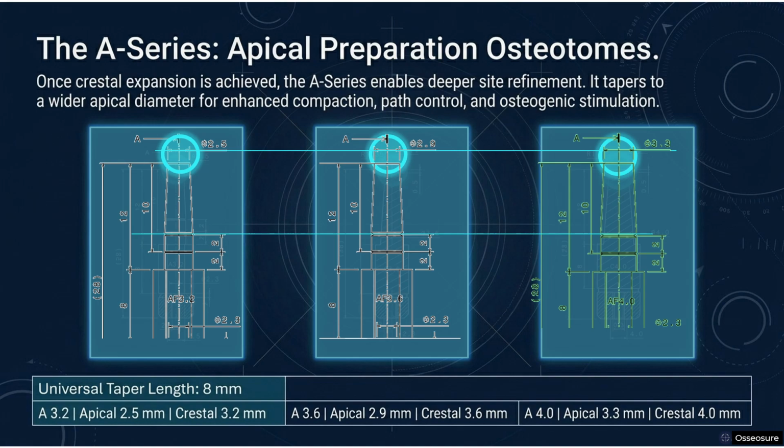After crestal bone preparation, you can think of preparing the apical bone. Normally, when we drill an osteotomy in hard bone, there is always the possibility that the crestal bone becomes over-enlarged because resistance is at the crest and it destroys more bone than intended. And if you fail to reach the full depth at the apex, then two things will happen. Either your implant keeps rotating at certain depth without advancing, or after reaching full depth, you don't have sufficient torque.